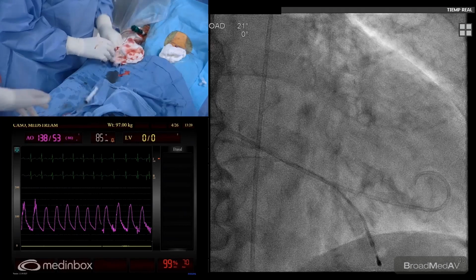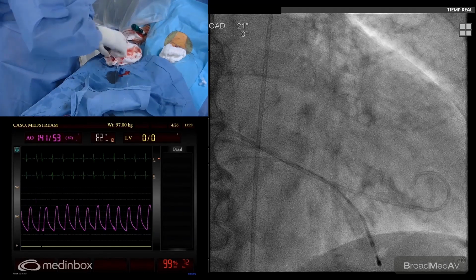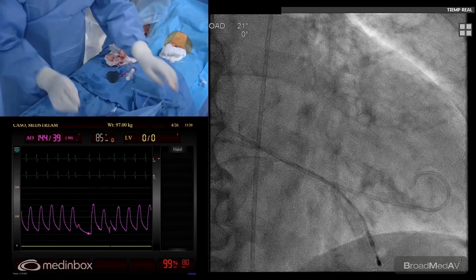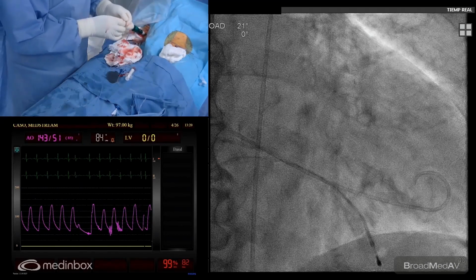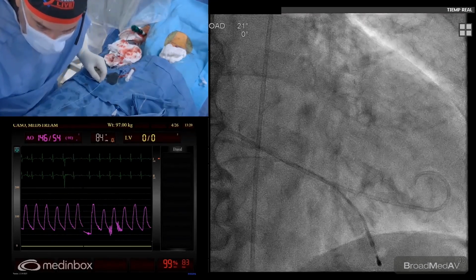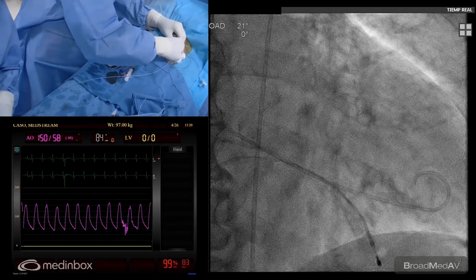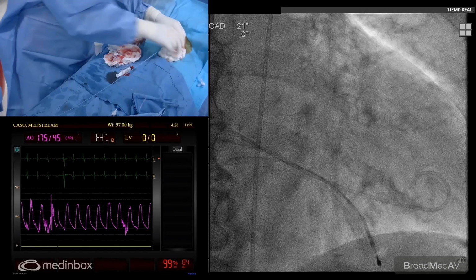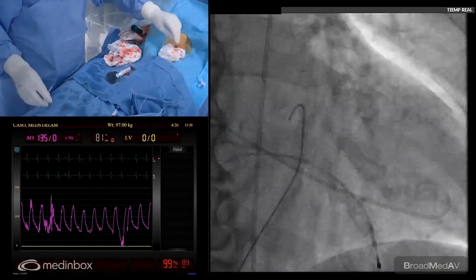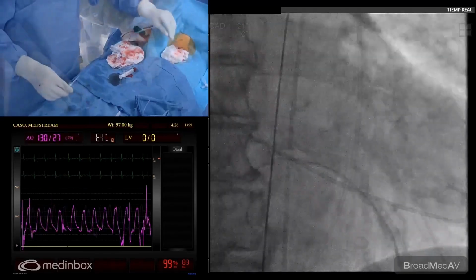In Argentina, we have availability of Myval and Edwards. We are very comfortable with Myval, which we have been using for the last couple of years. The second valve probably is between Accurate and Medtronic Evolut. But as you say, many times we cannot choose, so we have to adapt the valve to the patient, which is better than the inverse.